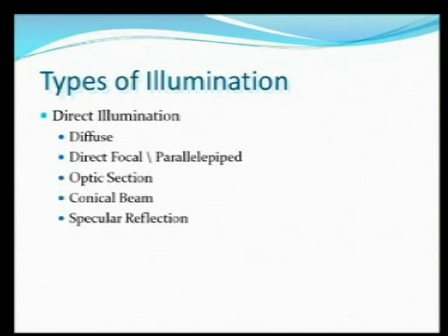A slit lamp is a lot like a projector. It's projecting a beam of light onto the eye. What's different is that we can control the width of the beam, we can control the height of the beam, we can control the intensity of the beam, and we can control the color of the beam. And through those manipulations, we can reveal different structures within the eye.